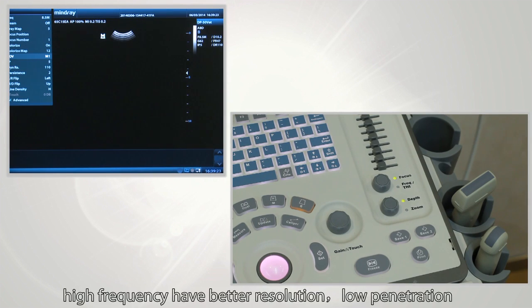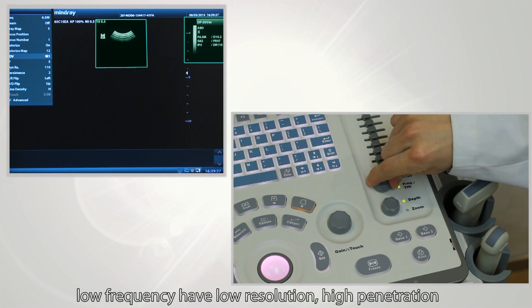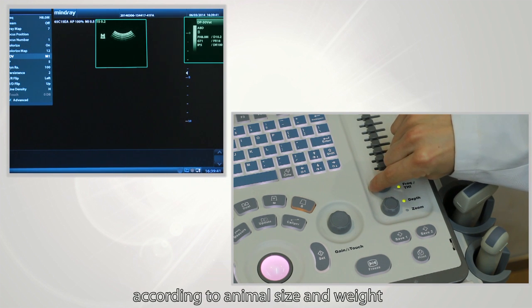Next, adjust frequency. High frequency gives better resolution but low penetration. Low frequency gives lower resolution but high penetration. Choose the right frequency according to animal size and weight.